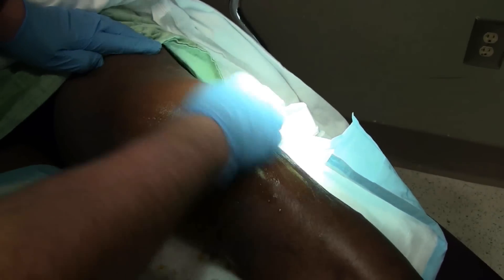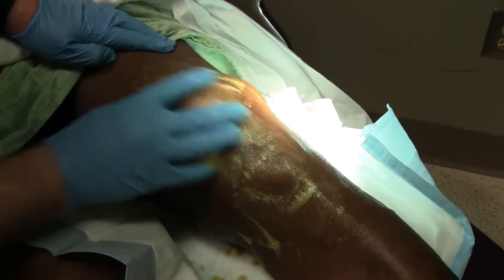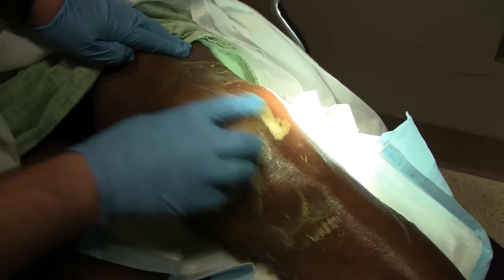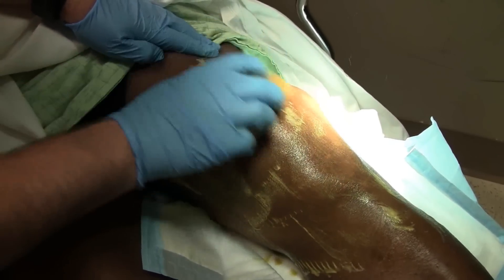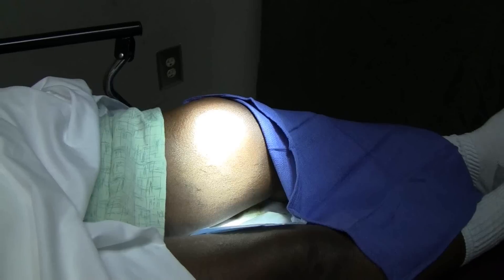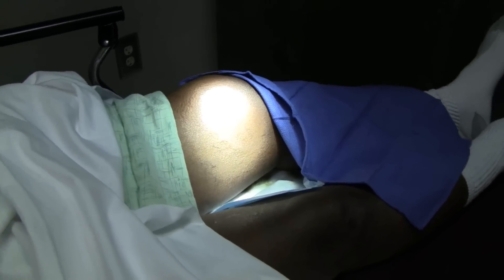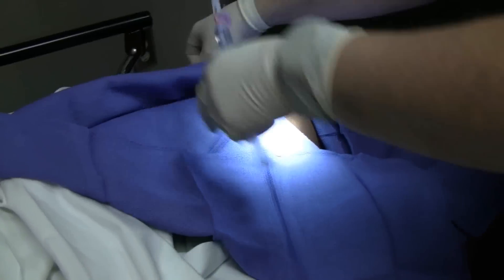We're going to do a real thorough scrubbing with some betadine scrub and we're going to do a medial approach on this knee joint. With major swelling like this, one thing you always consider is that you have too short a needle. I've elected to use a spinal needle to do the tap. We'll get this all scrubbed up, drape the knee, and start out with a little numbing medicine.